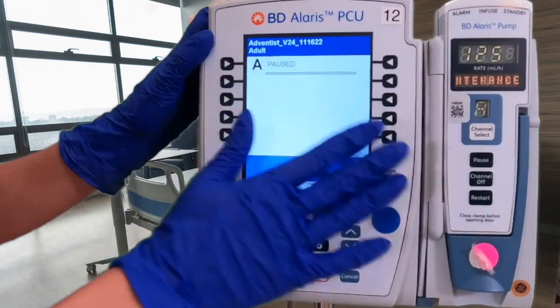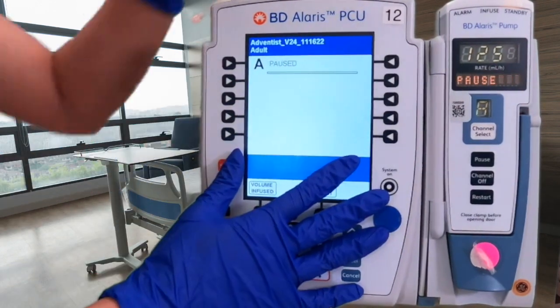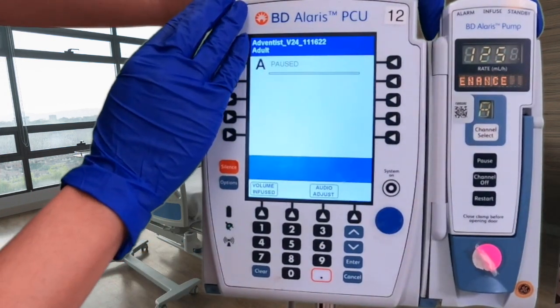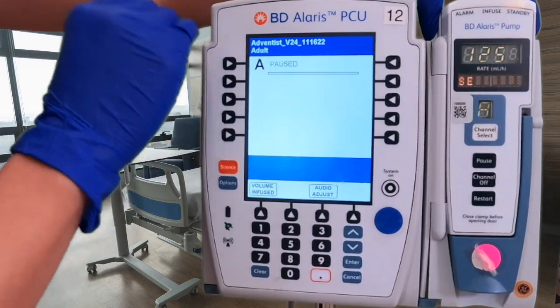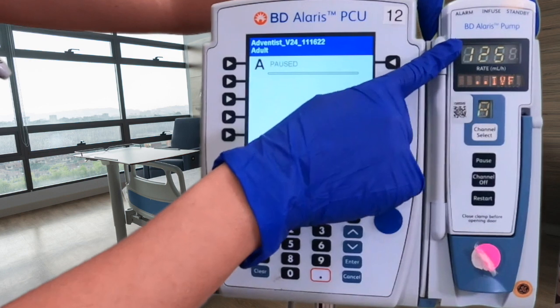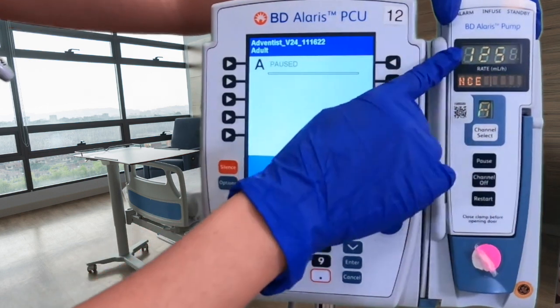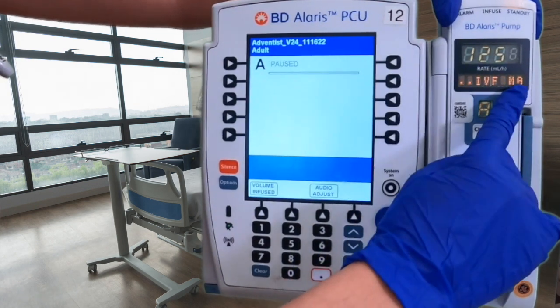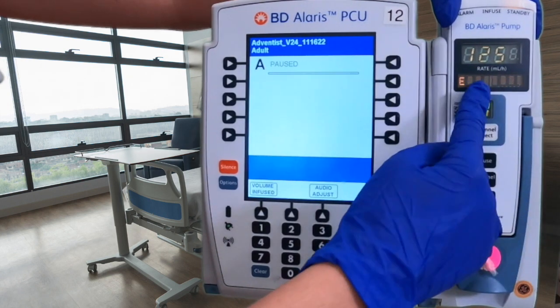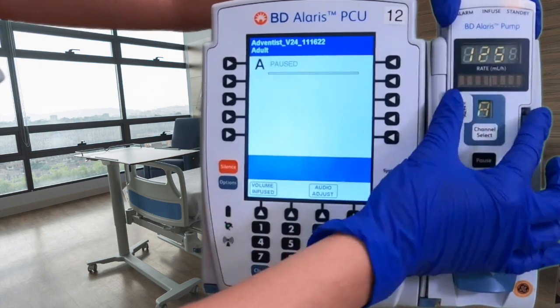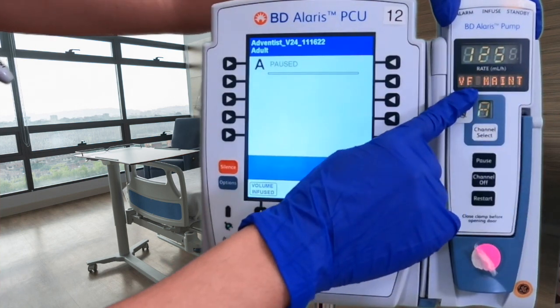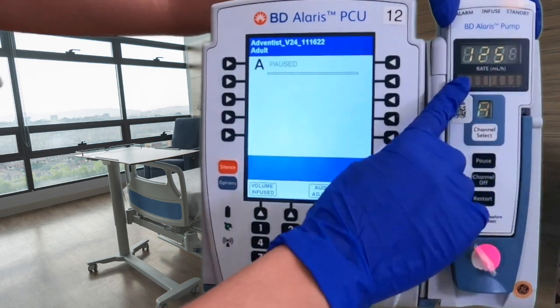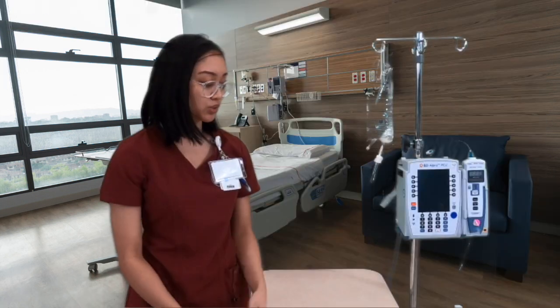I've paused the pump to mention something important. When you're coming onto the floor and getting a new patient and want to check what fluids they're on and the rate, you can see that information right here. The rate in mL/hr shows 125, and below it shows what we are infusing — IV fluid maintenance. The screen will also tell you if the pump is paused, and it will display any alarms such as an occlusion.